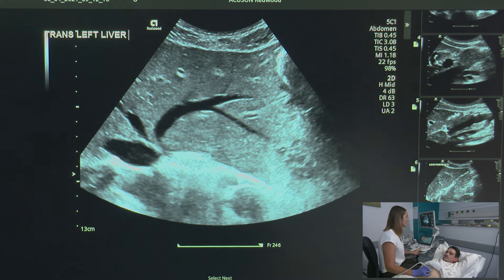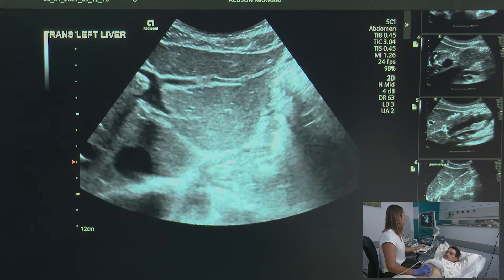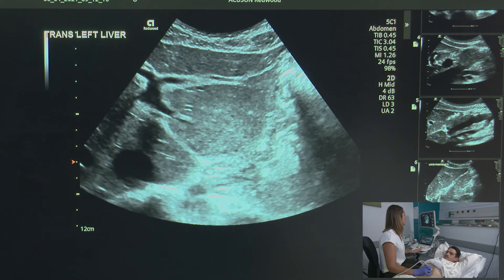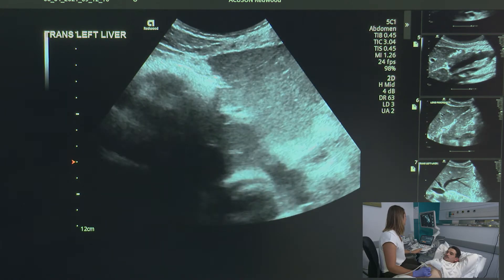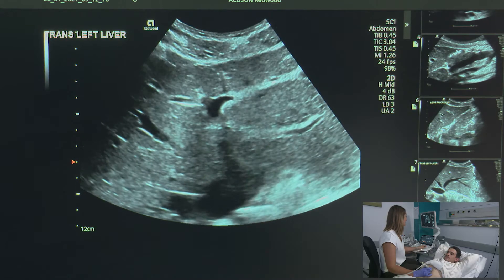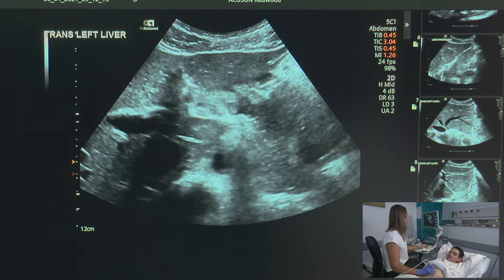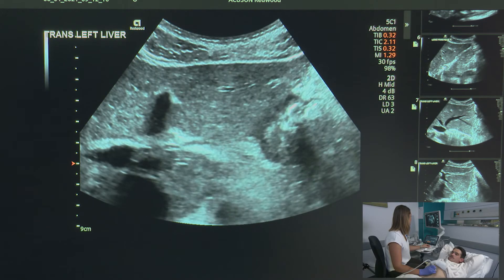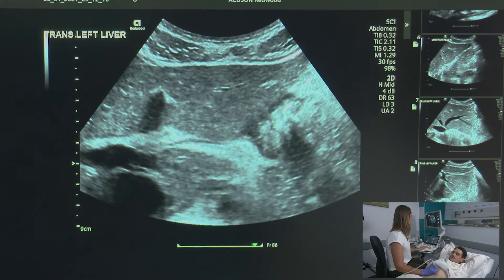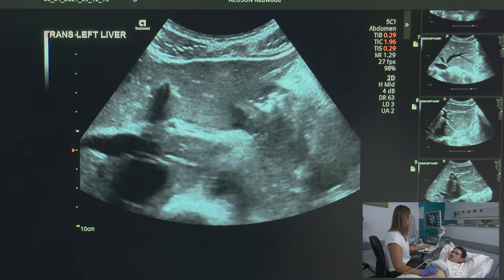The next image I'm going to take is just inferior towards the portal vein. Big breath in and hold that breath. I'm going to angle more towards the tip of the liver. Then I'm going to take one more at the same landmark but angling a bit more medially. The last image is just inferior to that portal vein. I'm moving my depth and my focus to be at the posterior level of the liver. Notice that I didn't ask Bruce to take a breath in because I could get the image without him holding his breath.